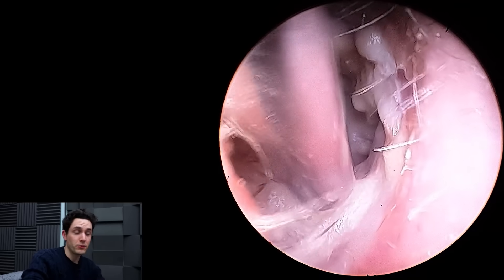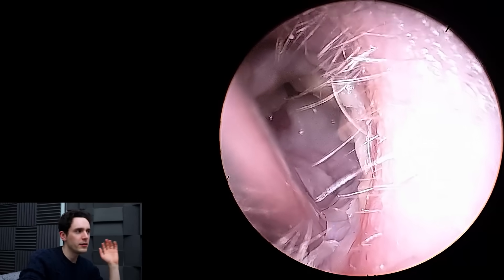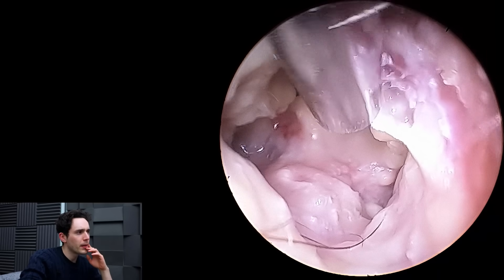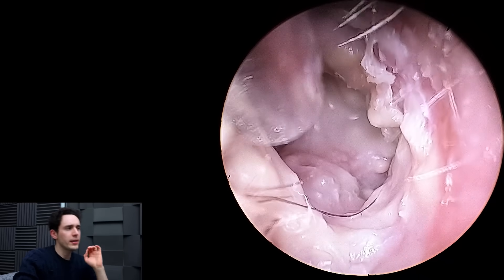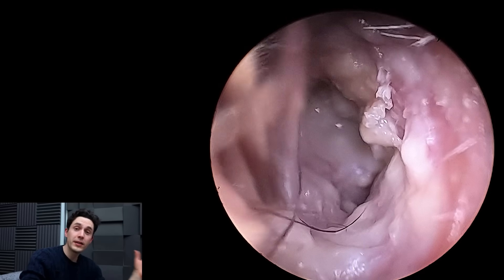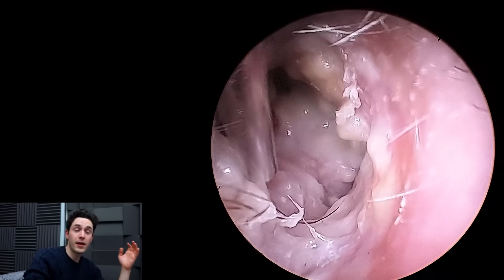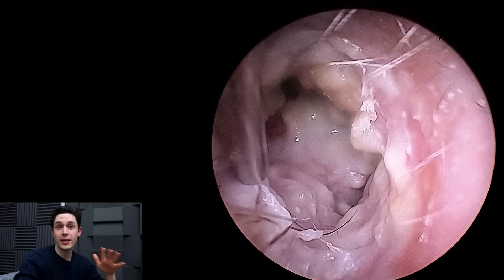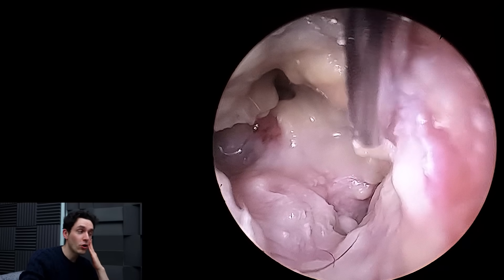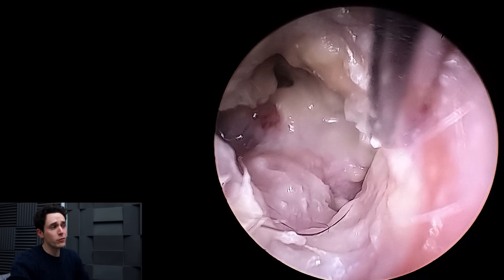This is clearly an infected mastoid cavity and it's probably been infected for a long time, because you can see there's granulation lurking back there just to the right of the sucker, and there's just pus everywhere. We think there's definitely one canal cholesteatoma in there and possibly another, but it's hidden behind the temporomandibular joint. If we are right, that patient will either need a condylectomy where the surgeon will have to remove part of the jaw joint, or we might be able to do it endoscopically. Either way, this is a very bad and unfortunate case.